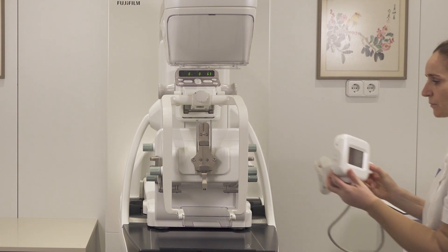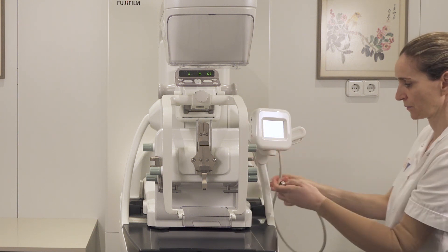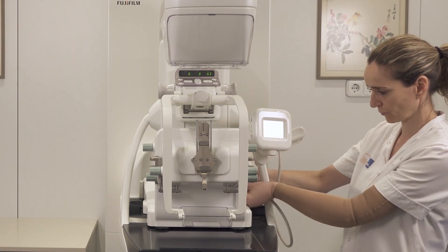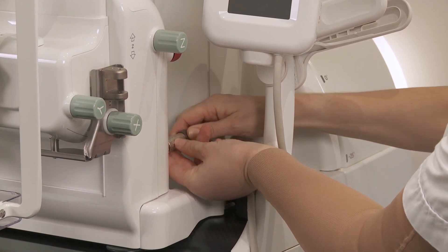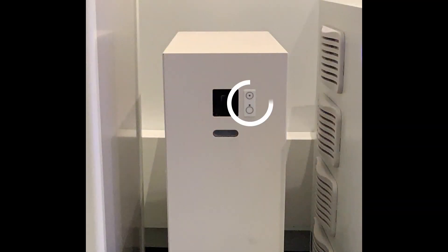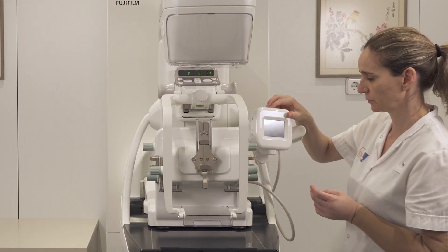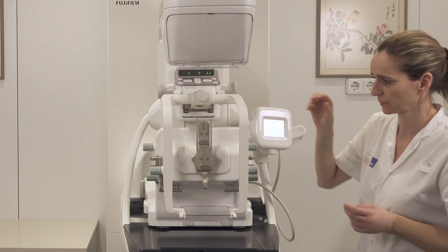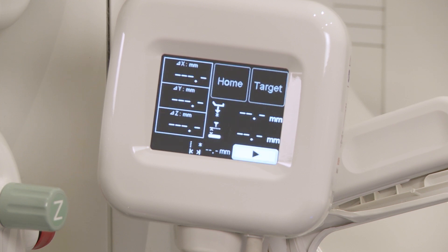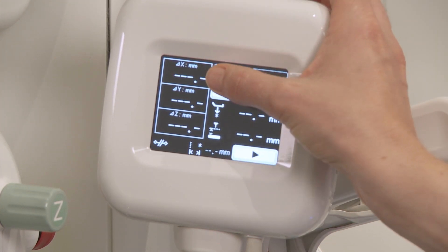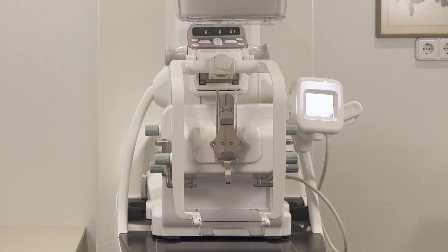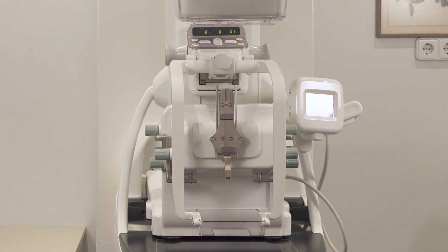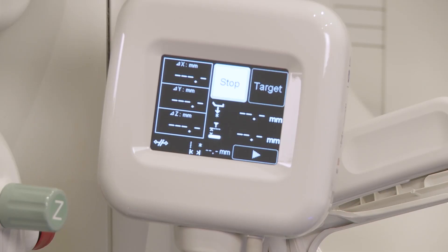Clip the operation panel on the preferred armrest and connect the cable to the back of the biopsy positioner. Turn on the positioner power control cabinet and wait about 10 seconds to switch on the operation panel. Initialization takes a few seconds. Press the home button to drive the positioner to home position. Press stop at any time to stop motion if needed.